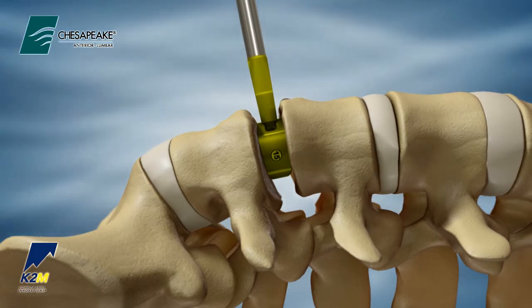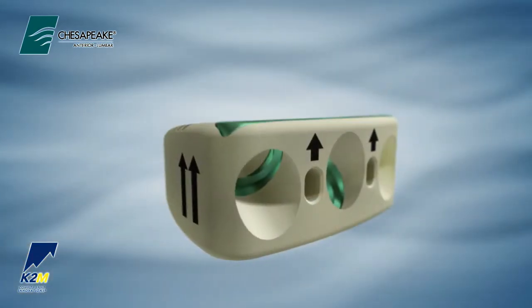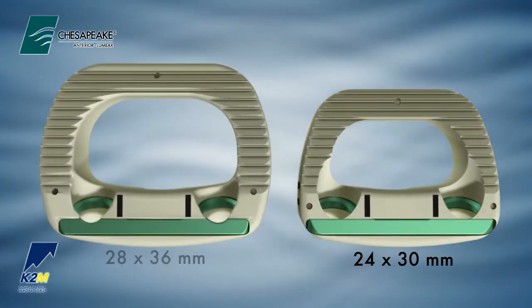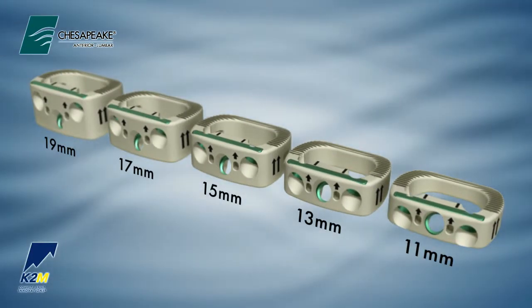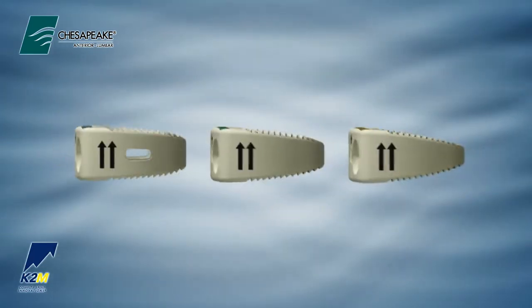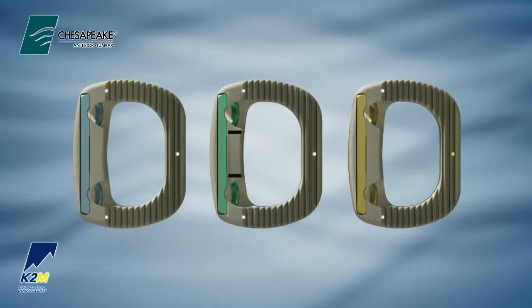If the trial appears to be too small, gradually increase the size until a secure fit is achieved. Chesapeake anterior lumbar implants are available in 24 by 30 mm and 28 by 36 mm footprints, in heights ranging from 11 to 19 mm in 2 mm increments. Each footprint has lordotic options of 5, 10, and 15 degrees and can be easily identified by color-coded Tyfix inserts.